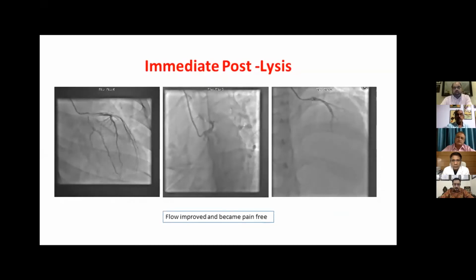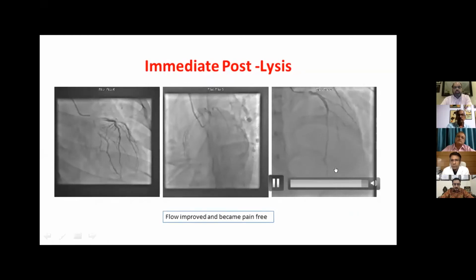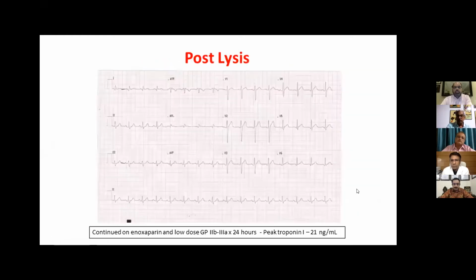So this is post-lysis. You just waited and you cleared the vessels and everything looks clean now. So the patient became pain-free. There's absolutely no need to stent these patients. STs come down, everything is clean.